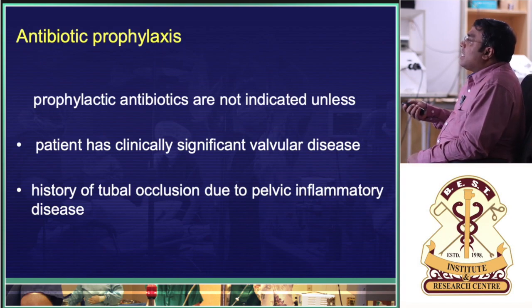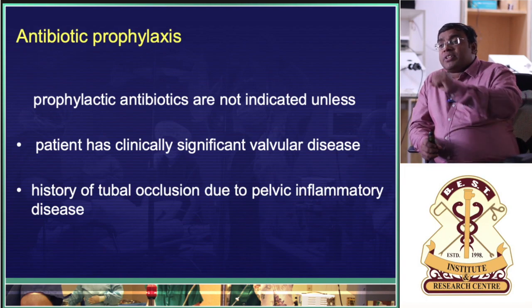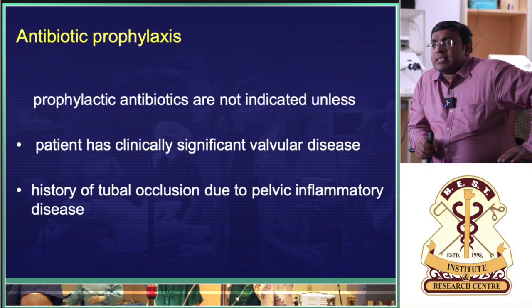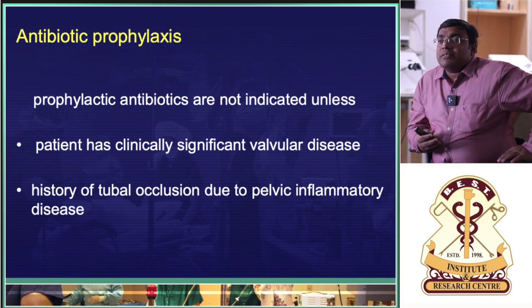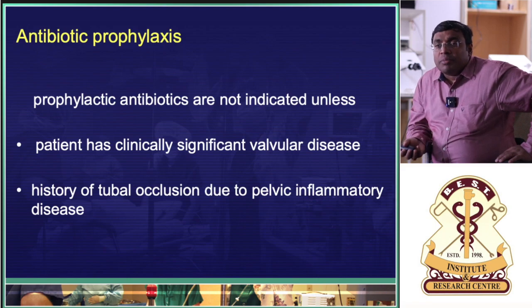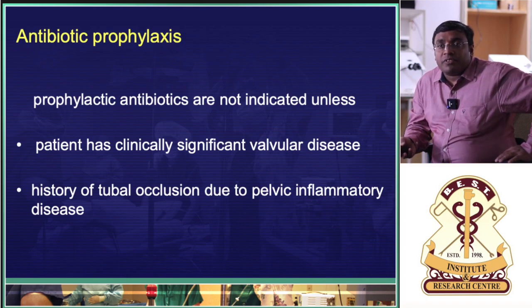Only if the patient has, suppose you are planned for a hysteroscopy, patient has severe vulvovaginal candidiasis, what do you do then? You abandon it? What do you do? Nicely toilet the vagina with saline and then with betadine. Make sure that all the mucous secretions that are there, everything is cleared off, and then go ahead with the hysteroscope.